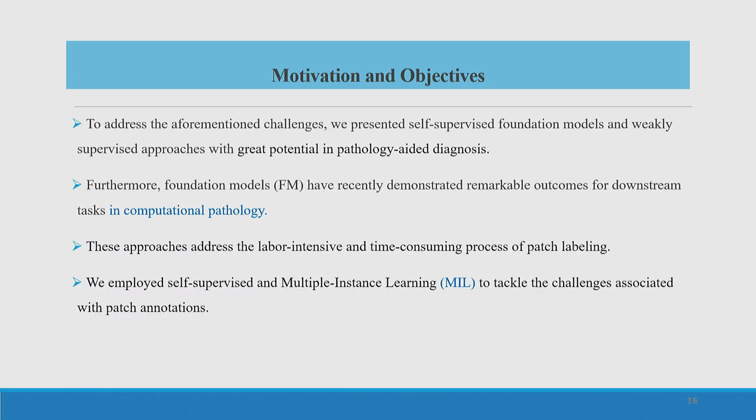To enhance the performance, we have used a foundation model. For the manual annotation problem, we have used a weakly supervised approach, which is very popular in pathology.